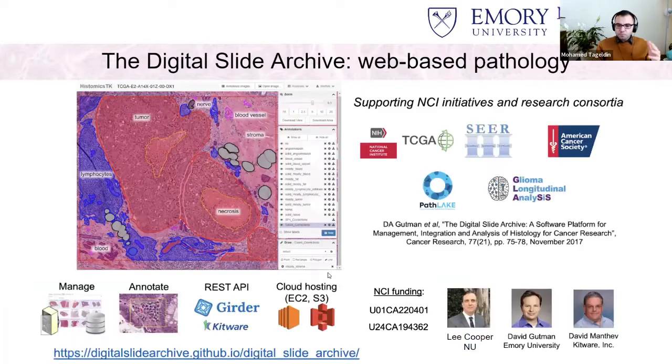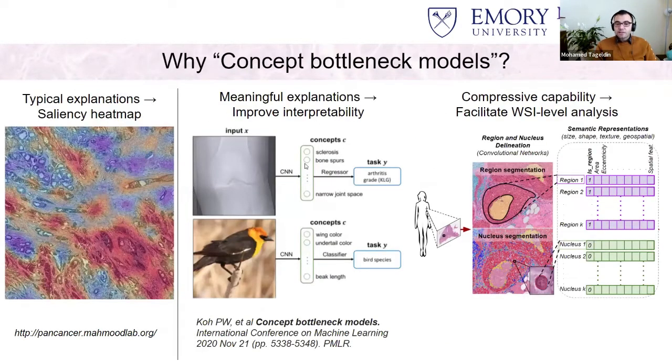Okay, so this is just to say that all of this was done in the backdrop of these collaborators, and was done using the Digital Slide Archive, which is a virtual slide annotation platform that we developed in collaboration with the company Kitware. Yeah, so it's basically a platform where people can log in from anywhere around the world. They can place their annotations from a set of predetermined classes, and then it immediately just gets saved to the server to create the data that we need to train these CNNs and to validate that they're detecting the correct concepts.